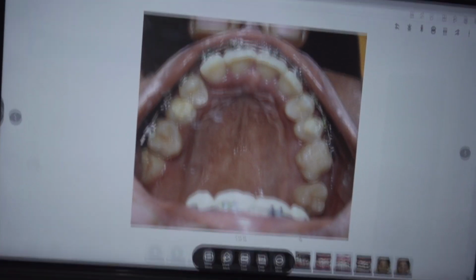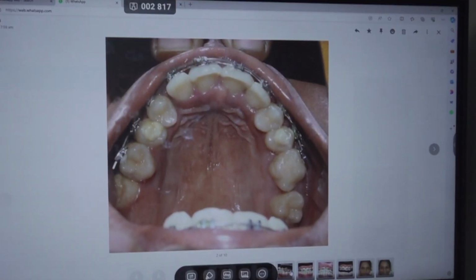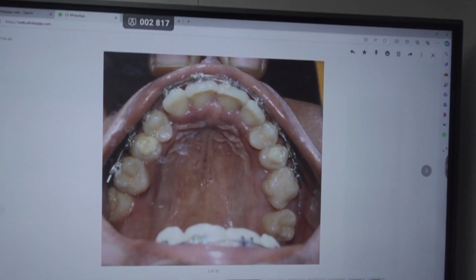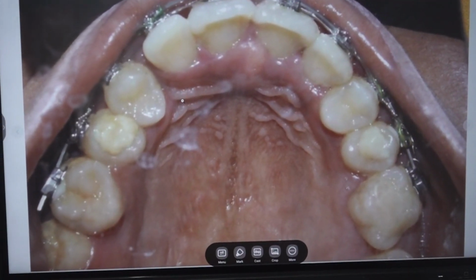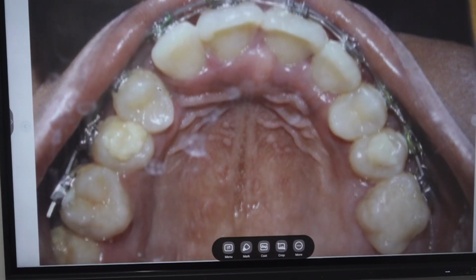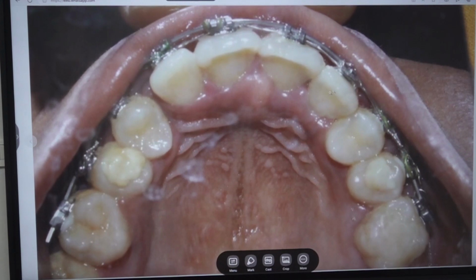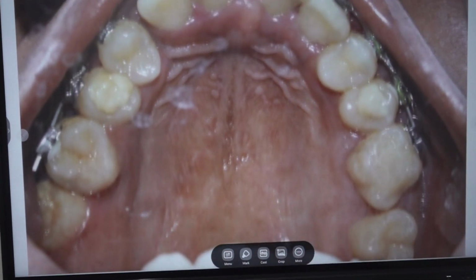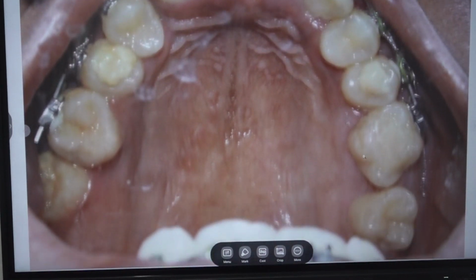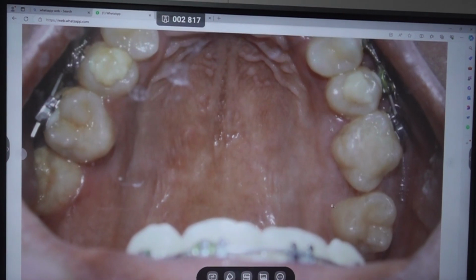Patient than somewhere else. All the upper teeth are in bad condition. You see, there is no premolar. Canine. There is no canine on both sides. Okay. This molar has been rotated too much here. This probably must be 1/8.